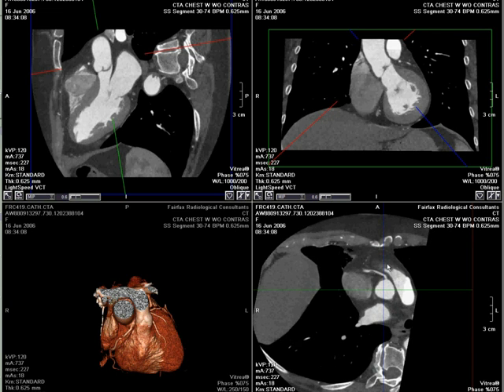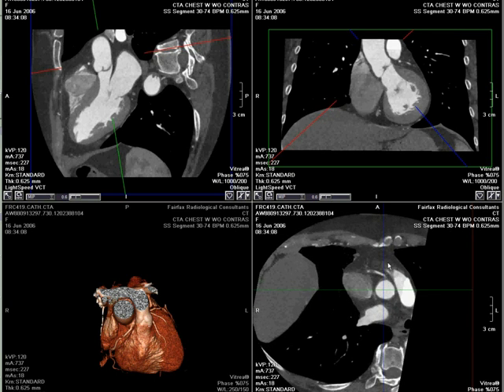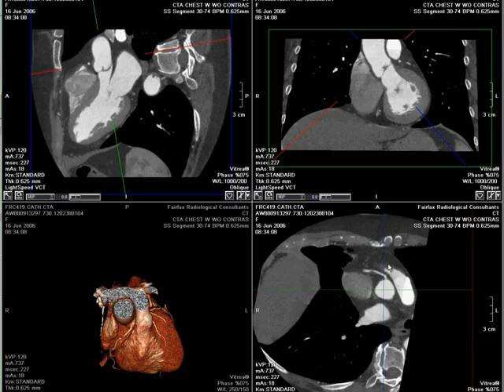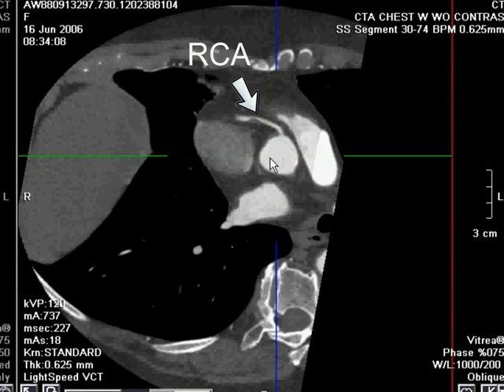This shows that the origin of the right coronary artery is normal. However, within the proximal right coronary artery there is an area of non-calcified plaque.